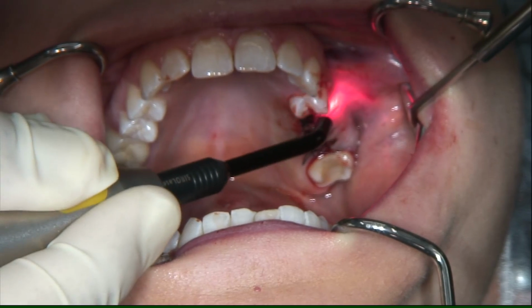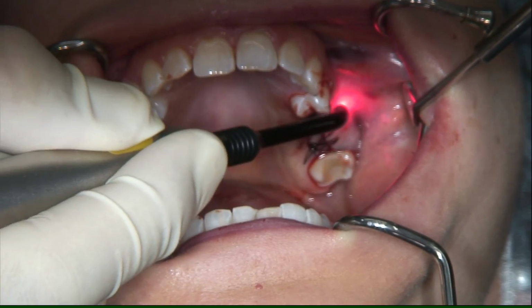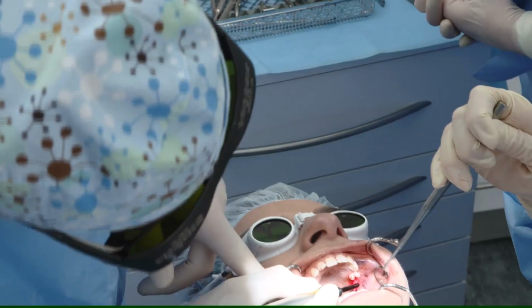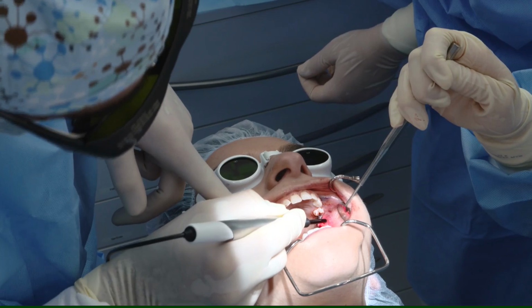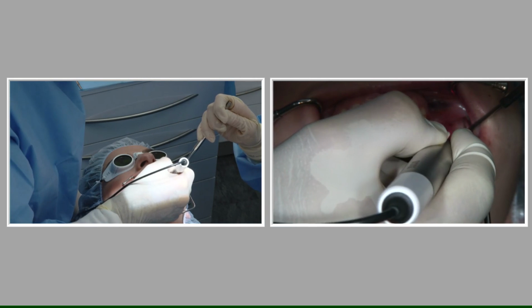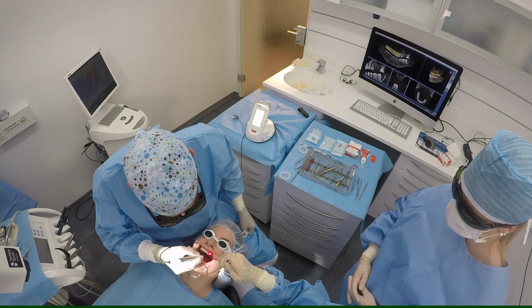I will give you a little information about the other mode while my colleague is using the soft laser. So with the blue diode, the absorption of the blue laser light in soft tissue is significantly higher than the infrared laser. This means the laser beam penetrates tissue less deeply, thereby reducing the risk of accidental injuries. So we have less heat.